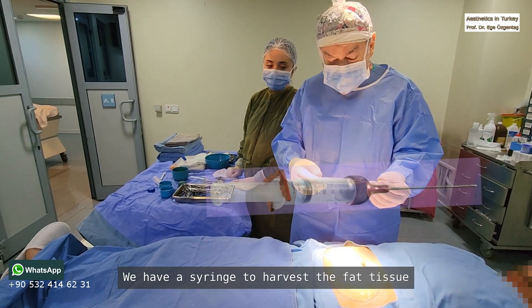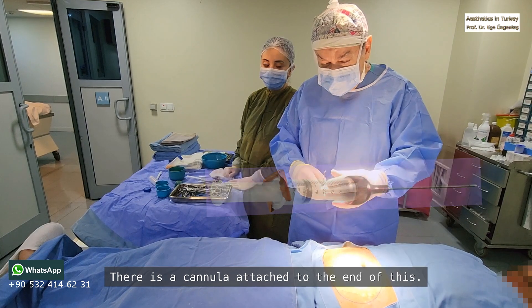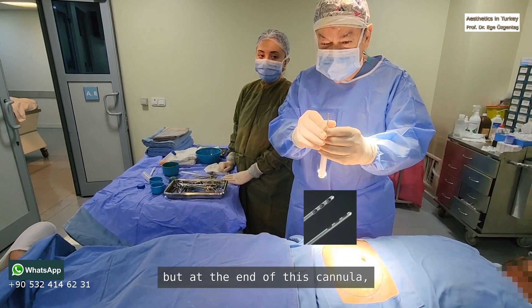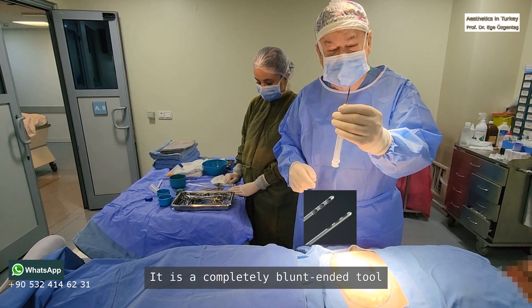We have a syringe to harvest the fat tissue. There is a small cannula attached to the end of this. You may not be able to see it clearly, but at the end of this cannula there are small holes. It's a completely blunt-ended tool.